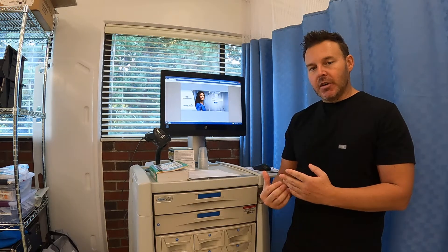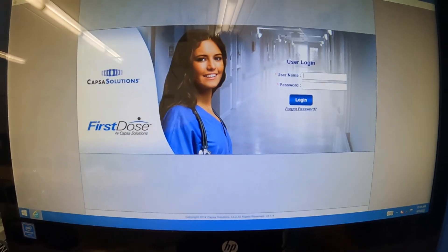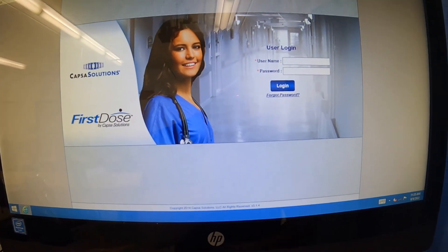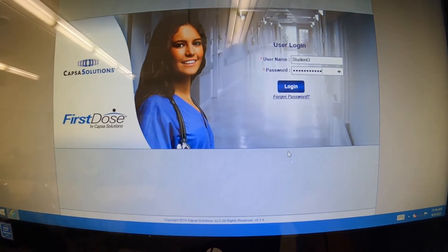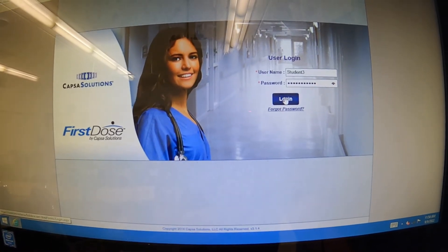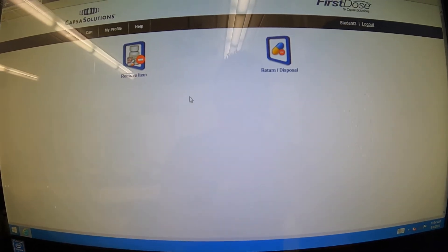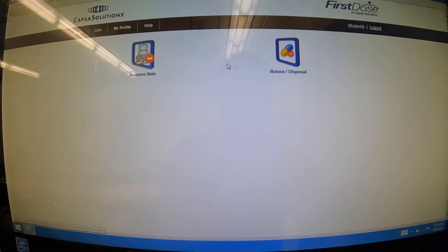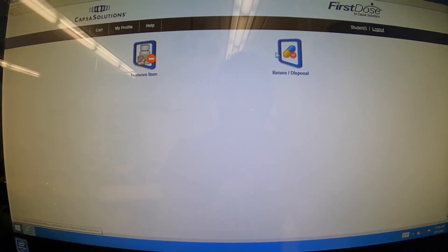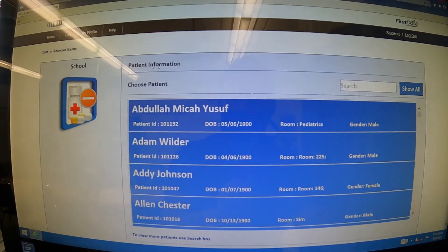But this is the basics of it — this screen right here. You're going to go ahead and enter your credentials that your instructor has given you. Once you enter your credentials, go ahead and hit login. It's going to bring you up here and you're going to see the remove item option, and here's going to be a return item. Today, we're only going to show the demonstration on how to remove an item, so click remove item.